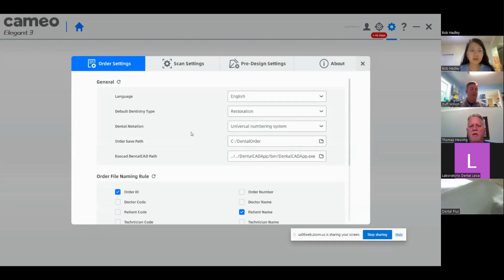The first time I used it, I didn't know about the AI feature, and I wasn't impressed. Then when I had my training with 8ite, they explained it very well, and I started showing the AI feature to the doctors, and they were wowed. So the price point and the yearly fees make it almost a no-brainer to have in the dental practice.